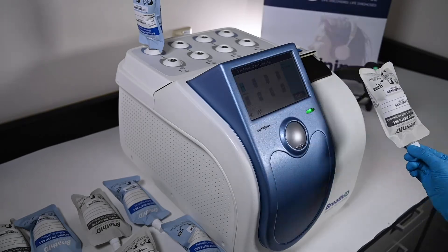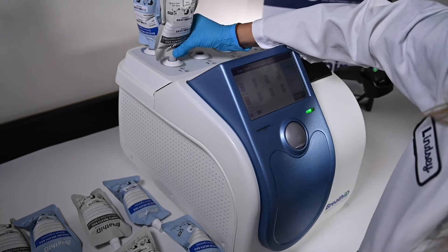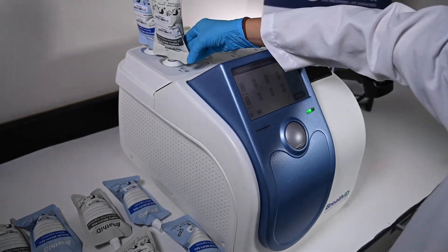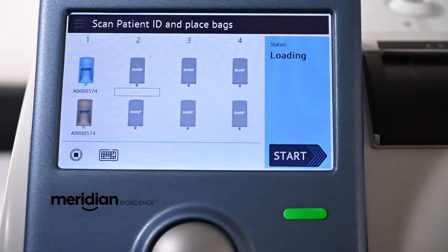Next, the user scans the gray post-ingestion breath bag and places it on the auto sampler at the gray port site. Both indicator lights will be illuminated green if the bags were inserted correctly, and an image of the bags will appear on the screen.